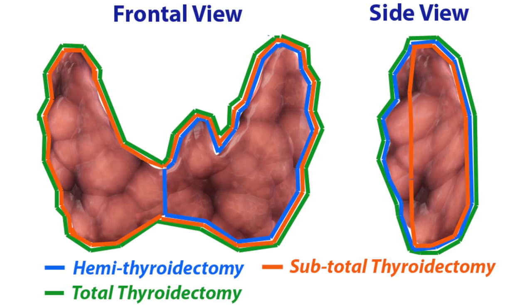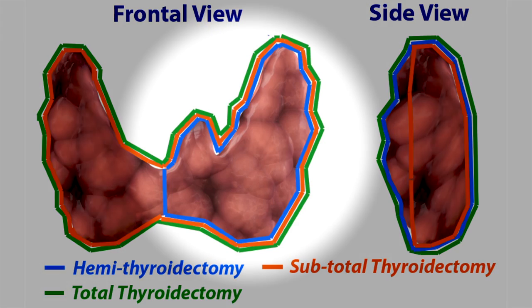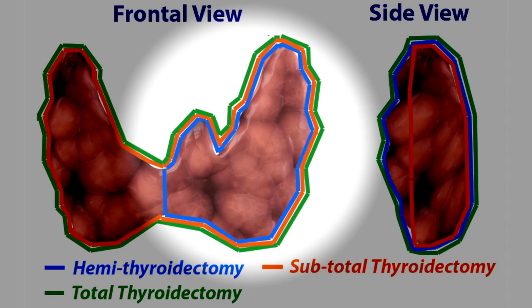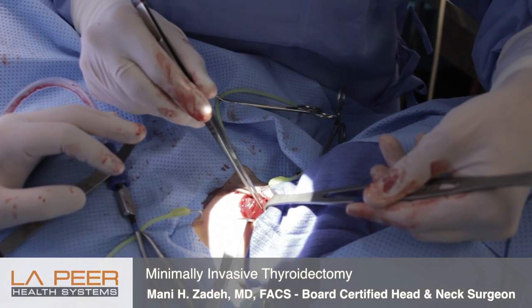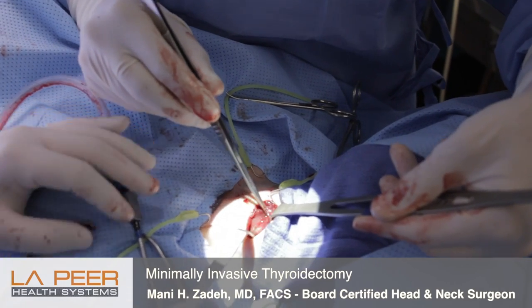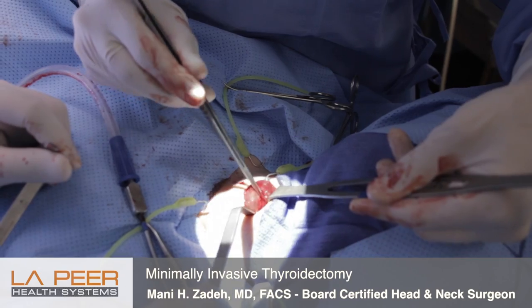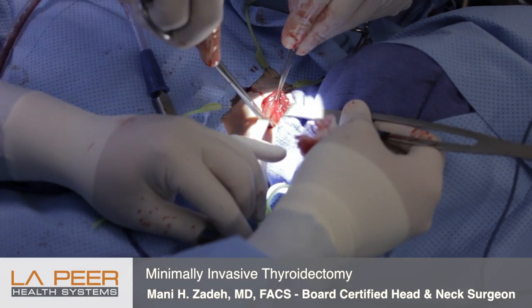This is the thyroid nodule here. This is the superior pole that we've cut and separated from the surrounding tissue and the vascular supply. I'm just teasing it out now. She has a very large gland, but this is only half of the thyroid.